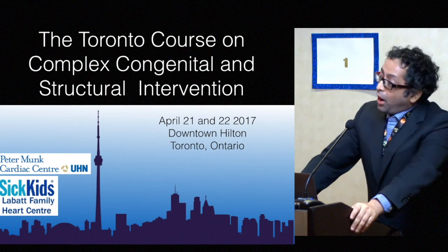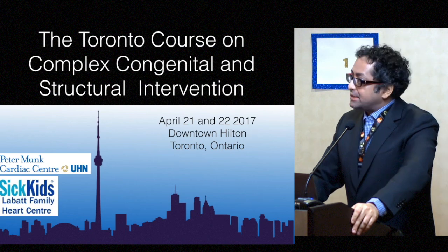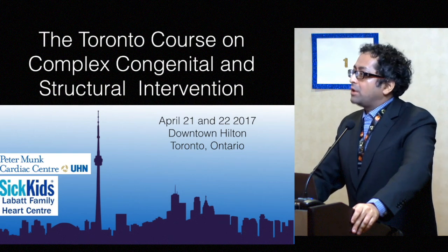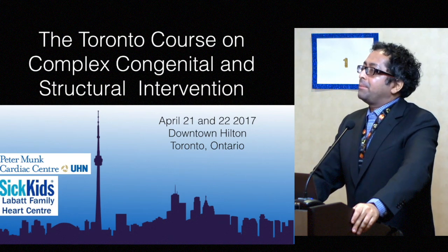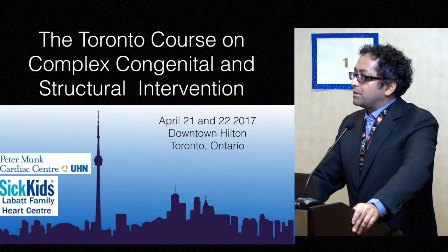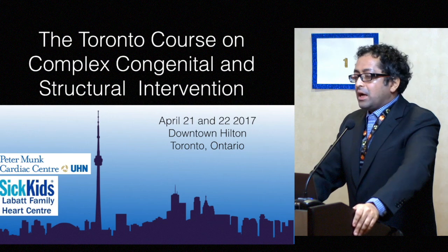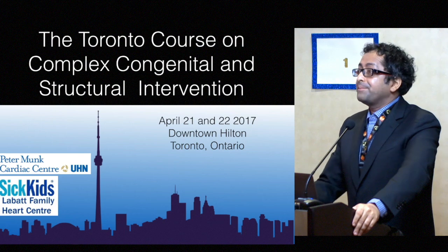Do you think there's any role for circulatory support with an Impella device in high-risk cases? Probably yes is the answer. It could be reasonable to use. We have not done that at this stage. We have done an Impella device in a patient who was crashing on a mitral procedure, because they were worried about the size of the arteries for bypass, for doing ECMO. But Impella was just sized, and even that was questionable. There were 3 millimeter arteries from below. But no, we don't routinely do that, even on the very sick patients. But it's a good thought.